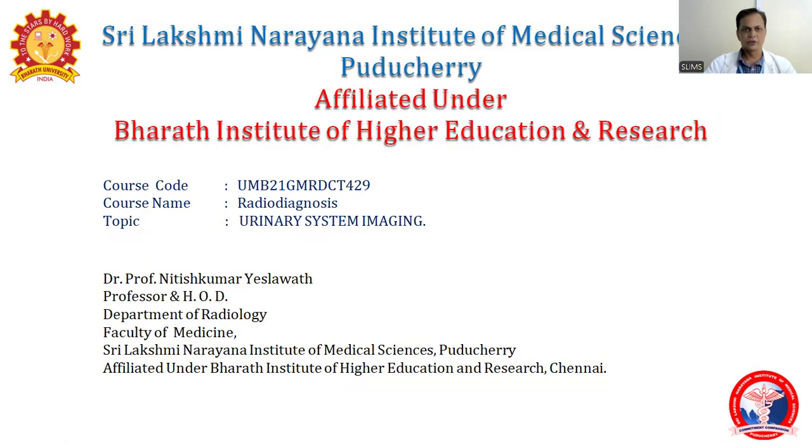Today, we'll have a discussion on urinary system imaging. We are going to see the simplest, easiest things for keeping in mind undergraduate students.